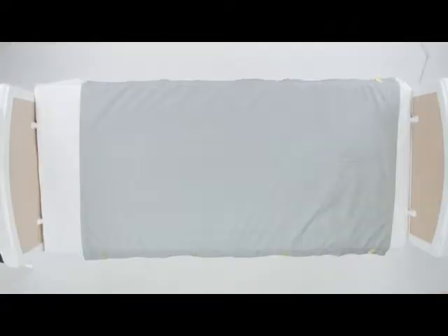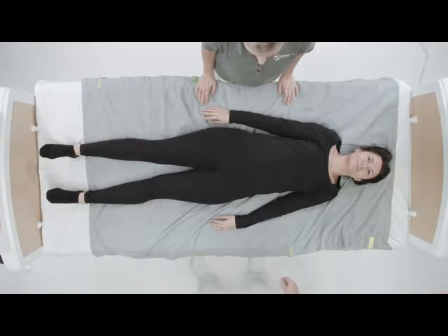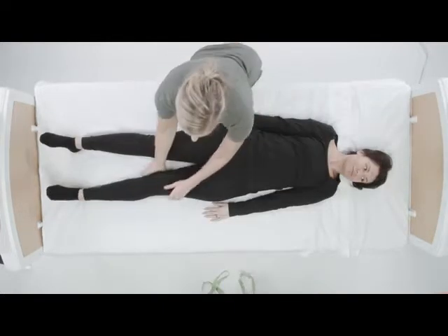The correct orientation for the sling under the patient is with the label facing up and away from any contact with the skin, like this picture. The patient should be placed like this so that the center of the sling lines up with the patient's spine.